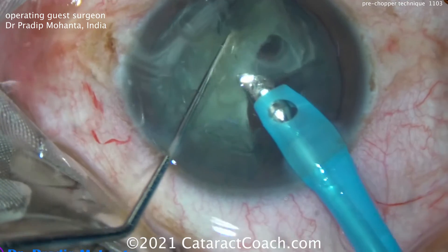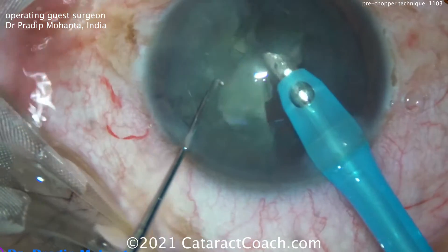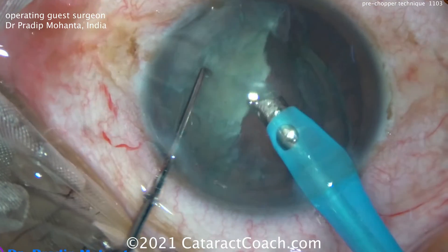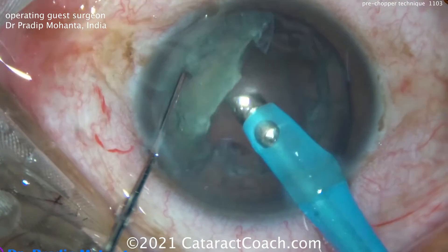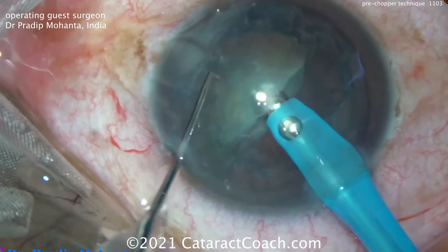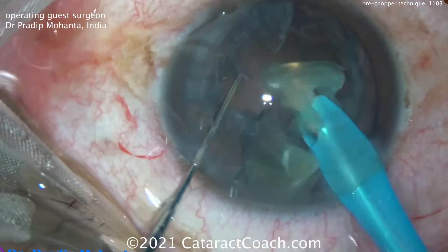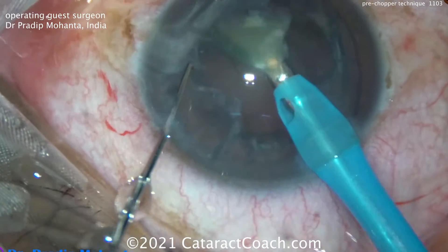I like this instrument design from Dr. Sohail Khan. I've not tried it myself yet, but I look forward to trying it in upcoming cases, especially with my residents. I think it can be very useful. Here on CataractCoach.com we've shown many other techniques of splitting the nucleus with just mechanical means.